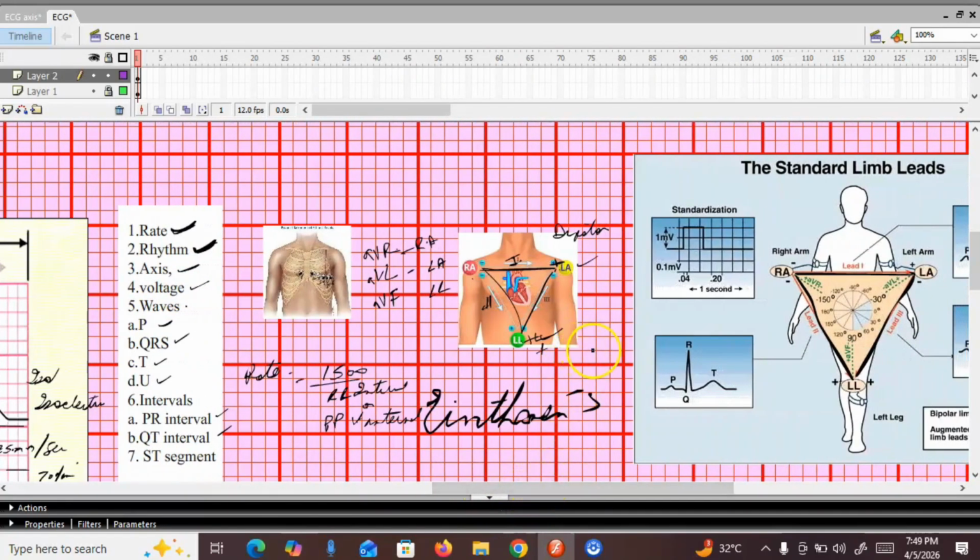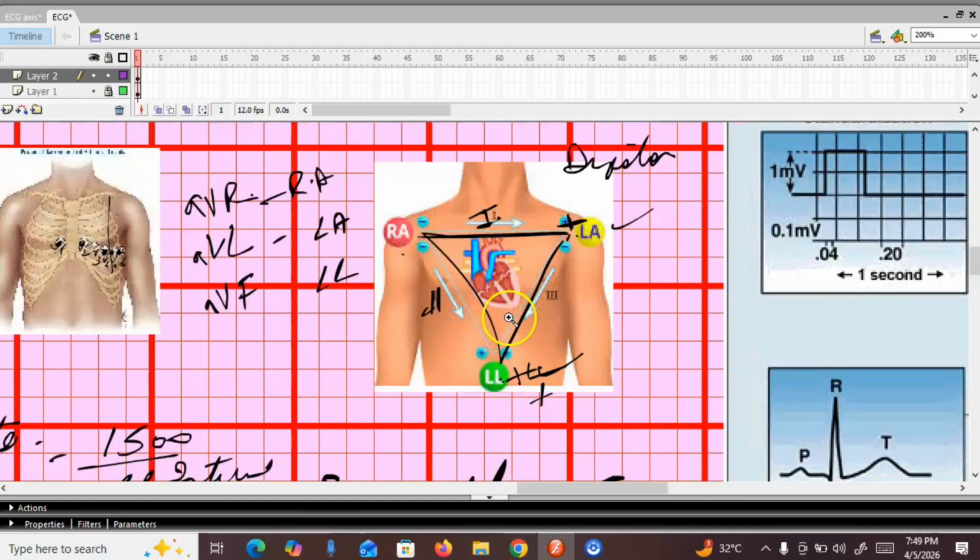Now we know that the left ventricle is the most prominent structure in the chambers of the heart. So if the person has got left ventricular hypertrophy, definitely the heart will tilt on that side. Hence the axis is important, and also the heart is slightly tilted towards the left. So how is the axis then? How do we calculate the axis?